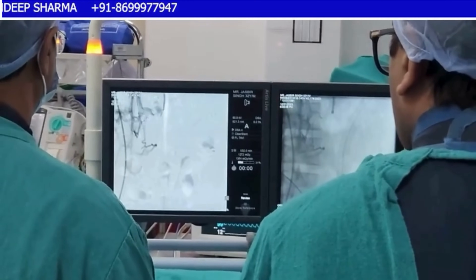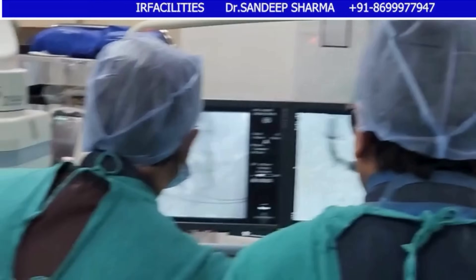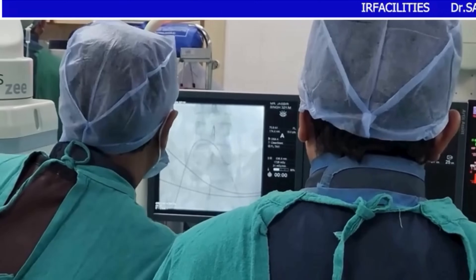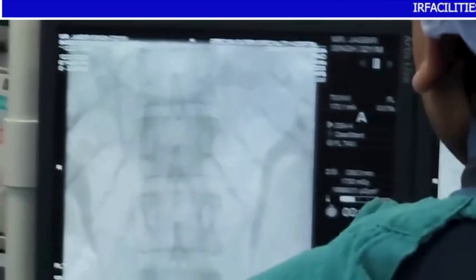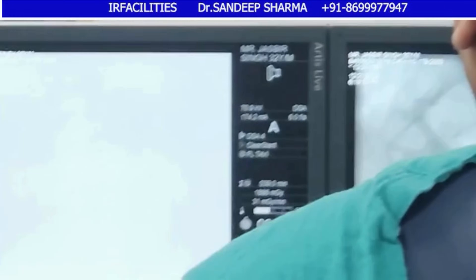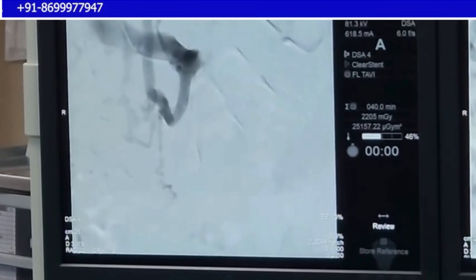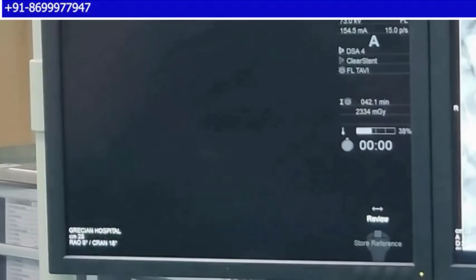We take a stronger contrast run of the azygous through the sheath but we see nothing - just azygous communications, a number of veins, and the communication with the IVC. We are not seeing any testicular vein at all. We decide to form a Sim catheter - this is the RC2 reformed into a Sim 2 - to explore the ostium region and the proximal area close by. I get a downward turn but I am not finding any testicular vein again. I am entering the azygous system and trying to find reflux into some other ostium, which we are not finding.